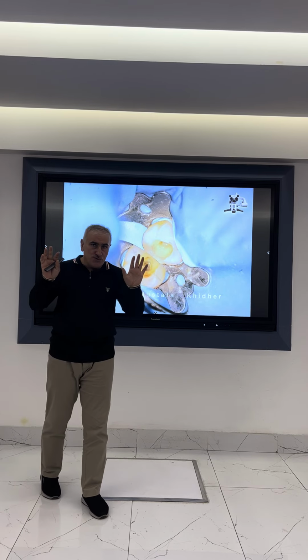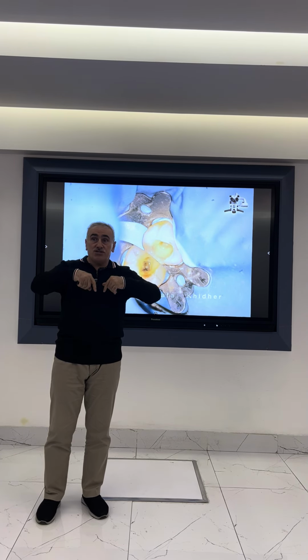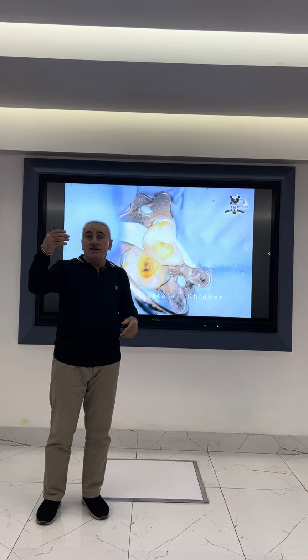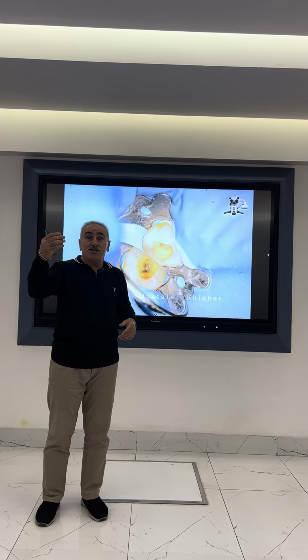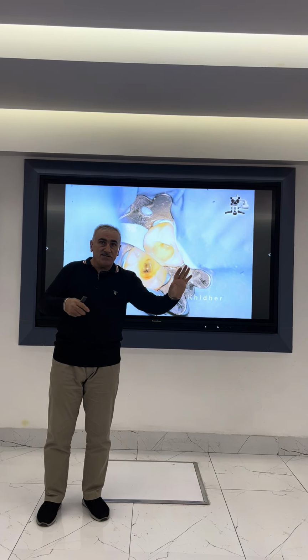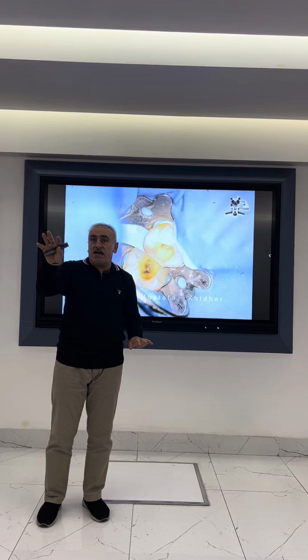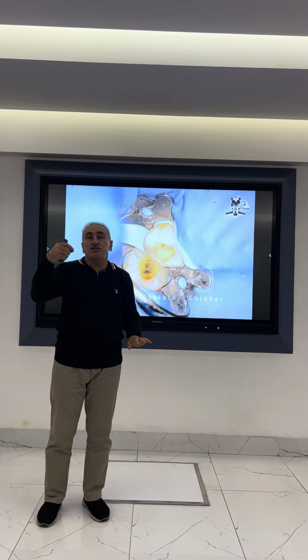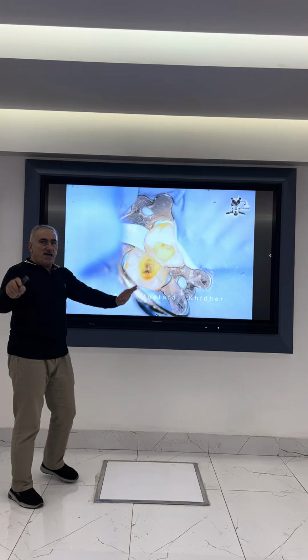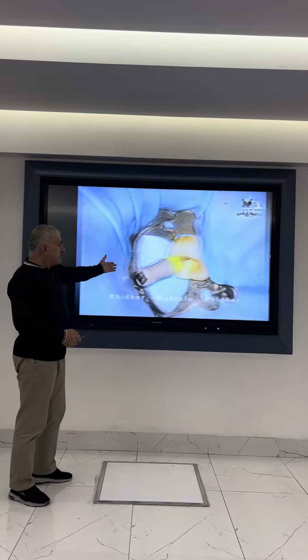Because in endo we have two scenarios. Either we have a case that is not contaminated, where the endodontist should never introduce contamination, so we prevent contamination. Or we have a case that already has bacteria inside, so we decontaminate. We have these two scenarios in endo. So here I put the sodium hypochlorite inside.